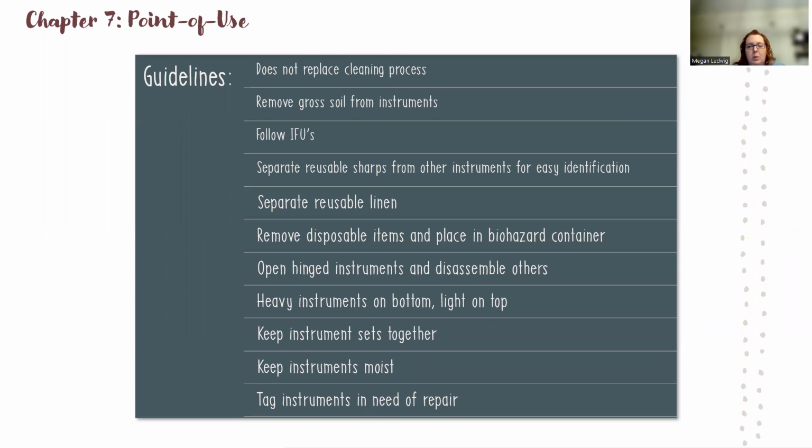Whenever we're using these at point of use or at the end of a surgical procedure, we always open the hinged instruments. That way you don't accidentally miss it in the sterilization or cleaning process and it stays clamped. We want those hinges to get cleaned and sterilized within the hinge as well. Anything that came disassembled, you also disassemble at the end of use. Don't leave things put together. You have to clean each individual part if it is supposed to be disassembled.